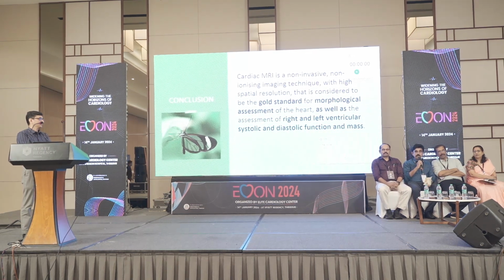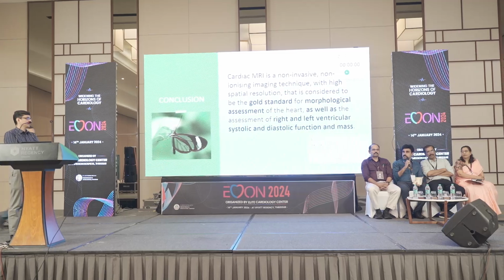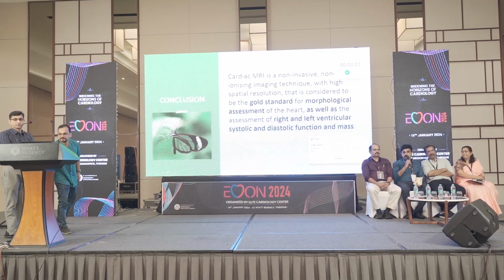It was a well-done talk covering all the aspects of MRI, cardiac MRI, for the functions and the anatomy. So now it is open for discussion. Any special preparation needed for the patient when we are sending for a cardiac MRI?